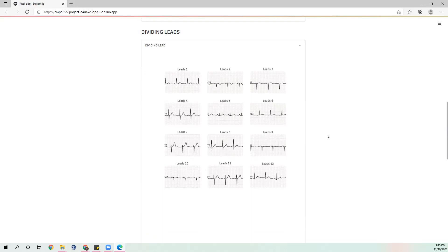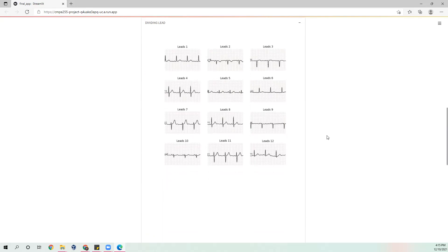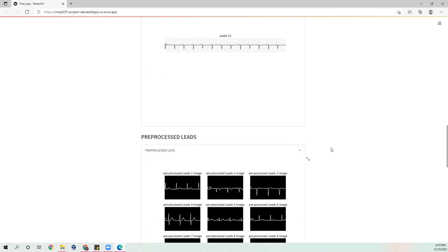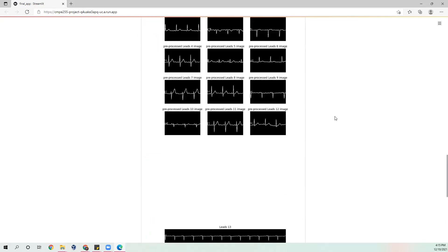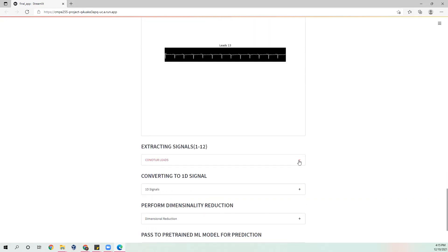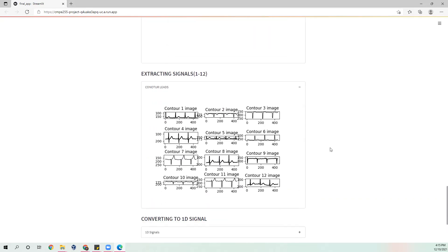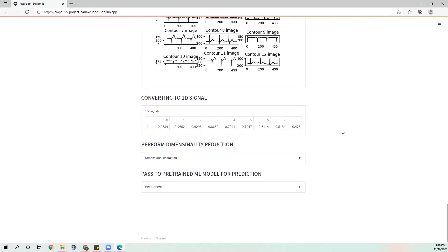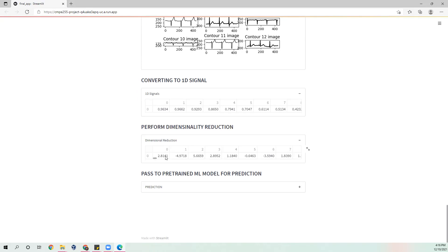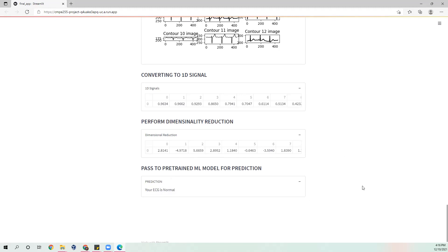Then we have the step of dividing the leads. Then this is how we are pre-processing it, wherein we are removing the background. This is the extraction of those signals. We are converting it into one-dimensional signals. Then on applying dimensionality reduction, this is how the data will look. And then this is the final prediction that we have got.